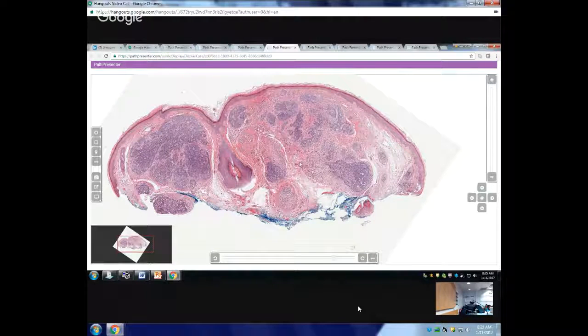What is going to be a big deal is missing a basal cell carcinoma. So very important is how do I rule out a basal cell carcinoma. If you have ruled it out, then even if you call it a basaloid adnexal neoplasm with benign features, and you don't remember the name 5 years down the line because you haven't done a lot of dermatopathology, you are still okay.